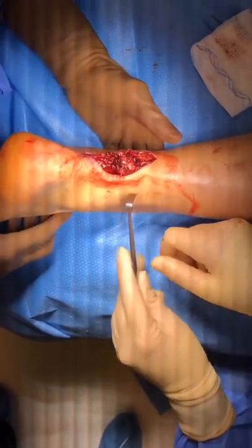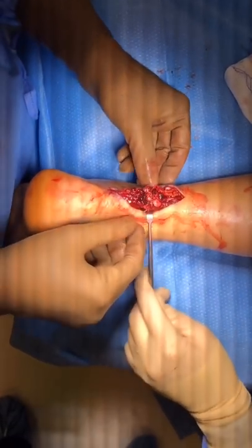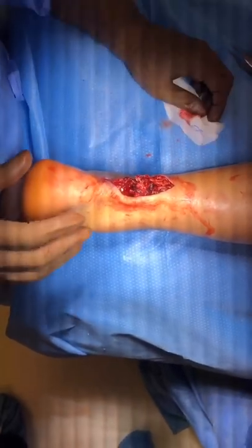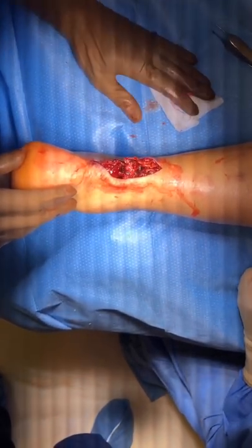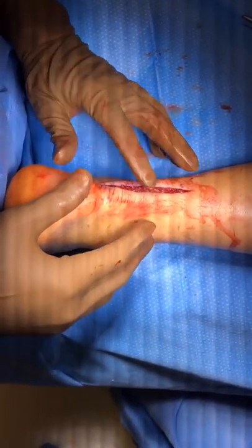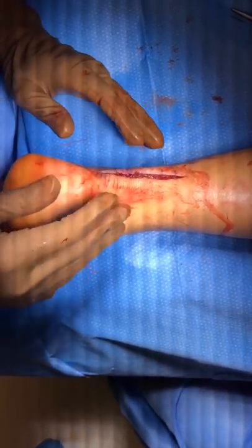Now you can see the Achilles is repaired — it is a stable repair. I take the ankle through a range of motion. We will close the peritenon and then the skin, then put the patient in a splint for one week with no weight bearing. After that, we let him start walking in a boot with wedges for another six weeks, then get him into a tennis shoe and work on rehabilitation. We hold on any significant athletic activity — high impact and cutting activities — for at least six months. Closing the tissue over the Achilles tendon and then the skin, the whole procedure took about 22 minutes. I would expect him to do very well.